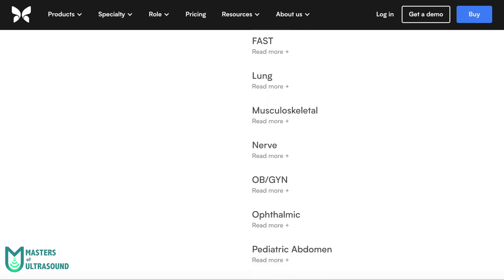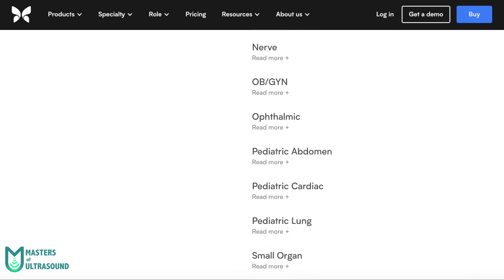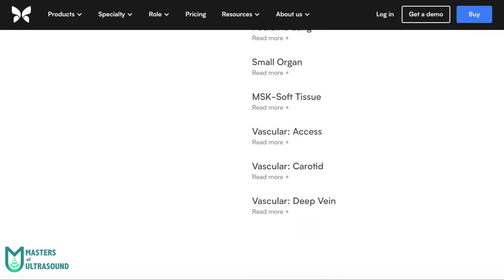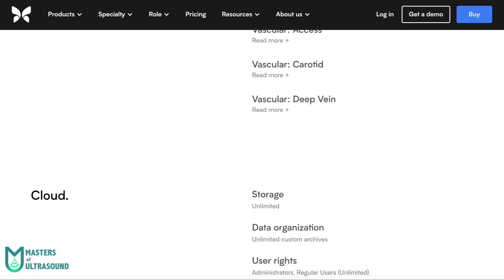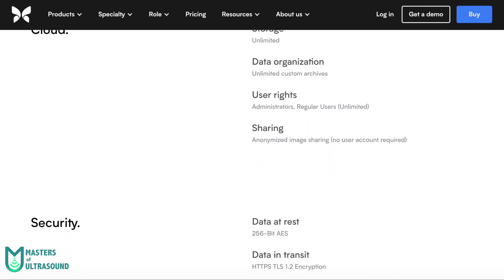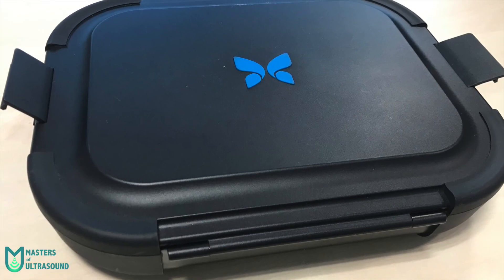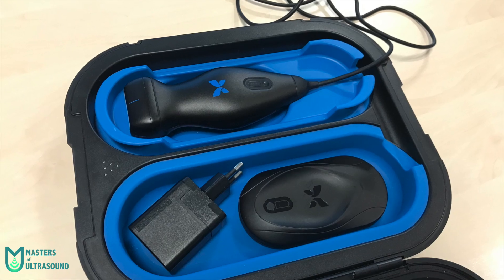You also have a lot of presets: Abdominal, Abdominal Dip, Aorta and Gallbladder, Bladder, Cardiac, Cardiac Dip, FAST, Lung, Musculoskeletal, Nerve, OB-GYN, Ophthalmic, Pediatric Abdomen, Pediatric Lung, Small Organ, Musculoskeletal Soft Tissue, Vascular Axis, Vascular Carotid, and Vascular Deep Vein. It's worth noting that all these modes are only available if you purchase the PRO subscription, which is an annual $420 subscription.